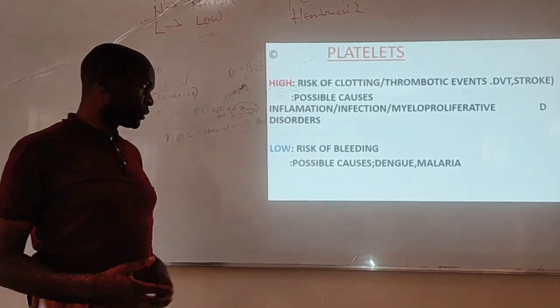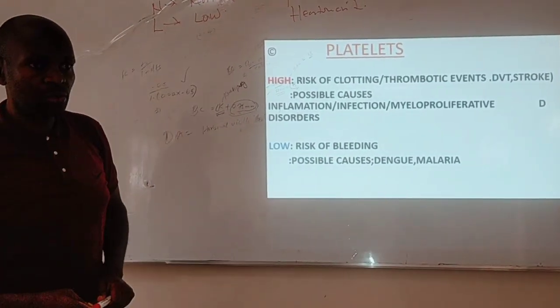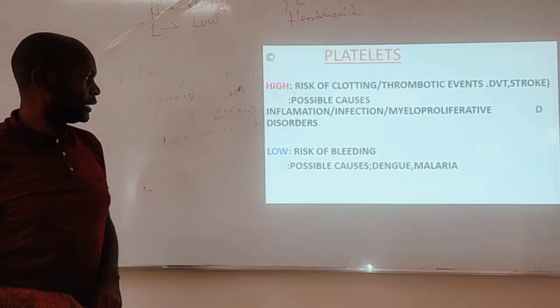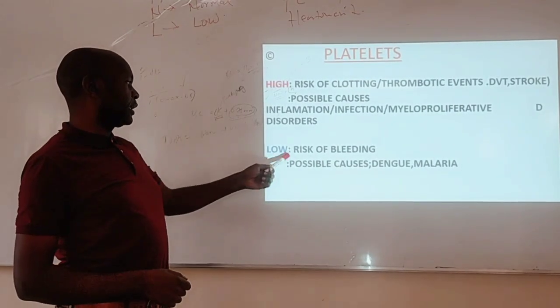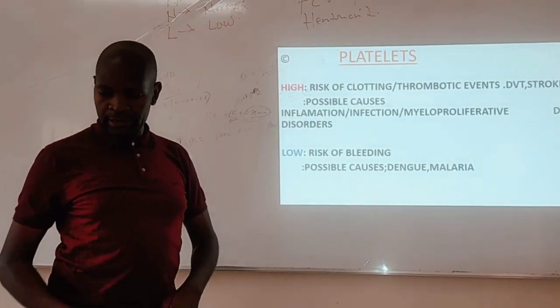Mostly possible causes could be dengue fever, a very common infection at the coastal area of Kenya. It can also be due to malaria. So these two tropical infections are the commonest possible causes of low platelet count.